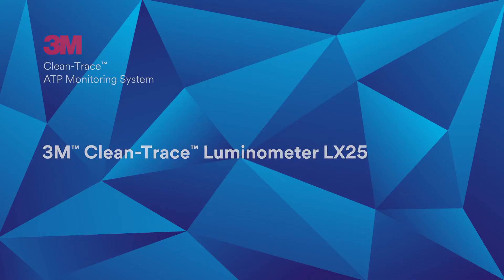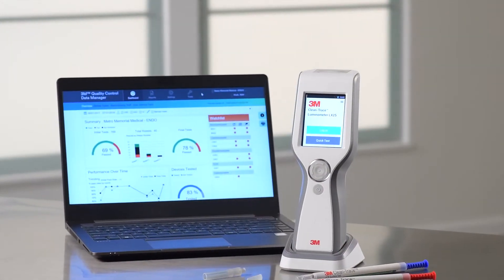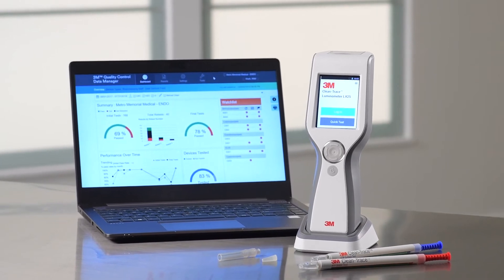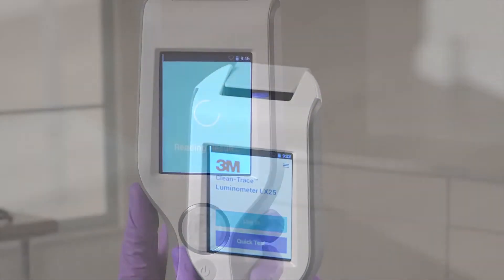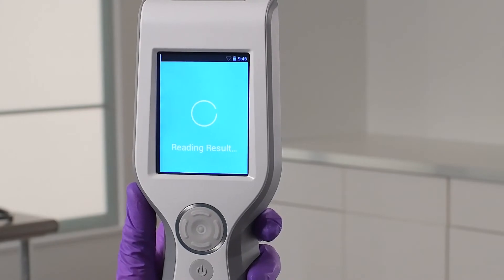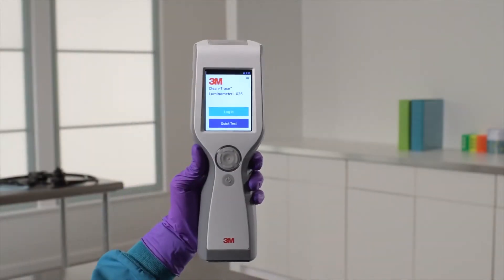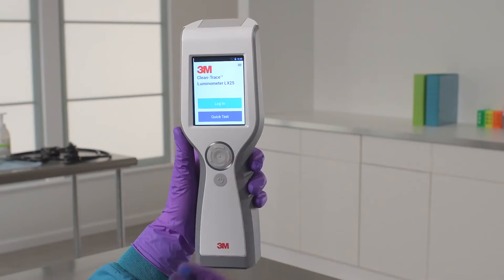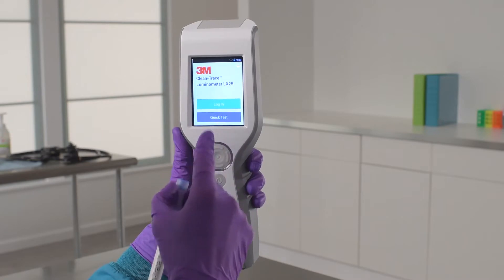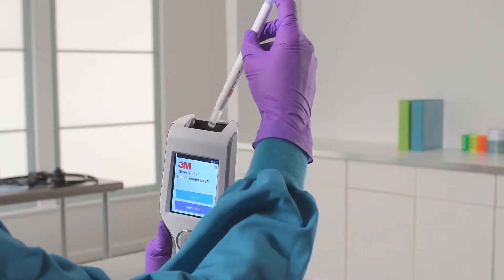The 3M CleanTrace Luminometer LX25 is a key component of the 3M CleanTrace ATP monitoring system, reading your samples and providing a rapid pass-fail result and a quantitative measure of cleanliness. It has an ergonomic design that fits comfortably in your hand, along with the colored touchscreen and on-screen prompts, and an easy-to-open test chamber for easy test insertion.